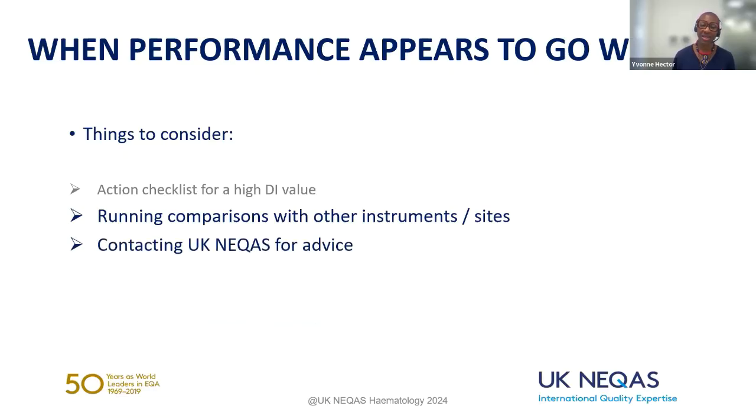We'd always advise contacting us for advice. Depending on timings and stock, we can send repeat samples for you to repeat analysis on. Myself, the service manager or the scheme director will review and offer advice on your observations and performance over the last 3 surveys. We do also contact manufacturers.